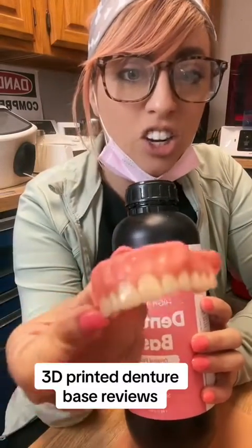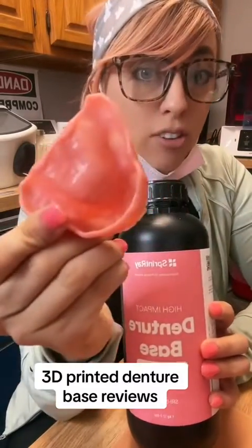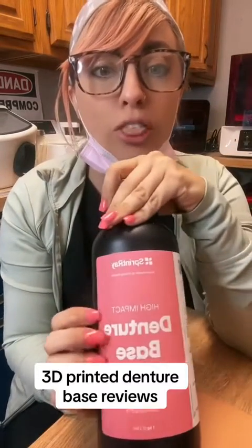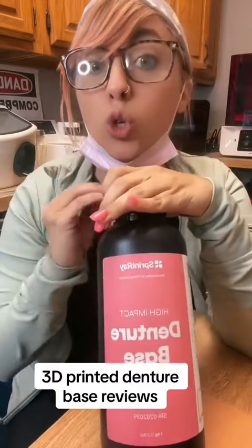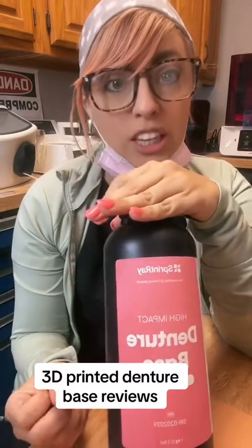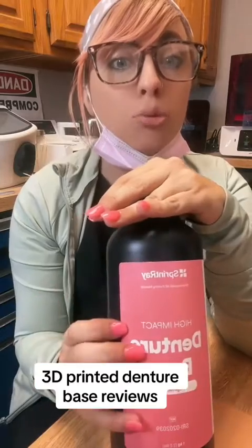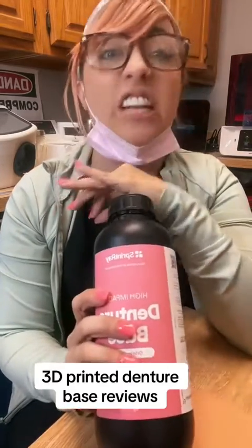I just got this one — the Sprint Ray denture base — right here. No translucency whatsoever. I got so used to it being translucent, and then I switched to this. It can withstand a one-story drop down to a tile floor, can be thrown across the room. I'm a huge fan of this one along with their denture teeth — super lightweight but also super strong, which is what I like. Onyx, in my opinion, is just a little bit heavy for dentures, so the Sprint Ray high-impact denture base and teeth is a fantastic alternative.